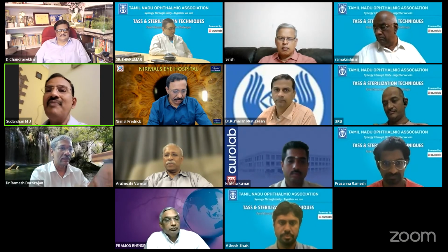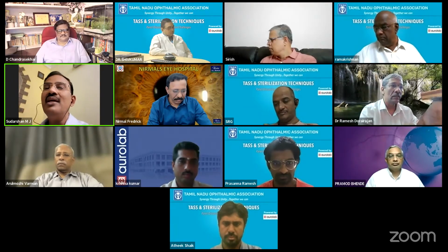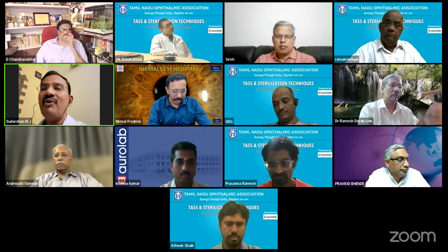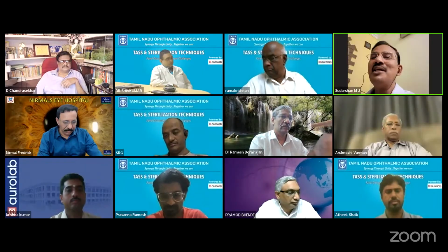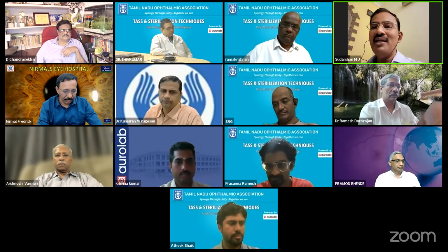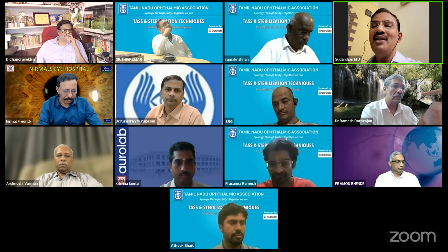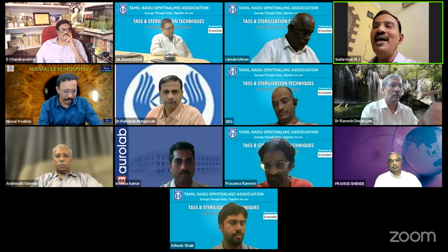What happened was in November, we started getting a few cases of TASS. These cases were like fibrinous reaction in the eye on the first post-operative day. Initially, we thought maybe we are not washing away the visco and the retained visco is causing this problem. So we thought of washing the eye thoroughly before closing the surgery. But this did not help us. Next day, there was a TASS. So we wanted to change the water that we are using for the autoclave. We actually started buying new cans from outside, RO water, and started using it.